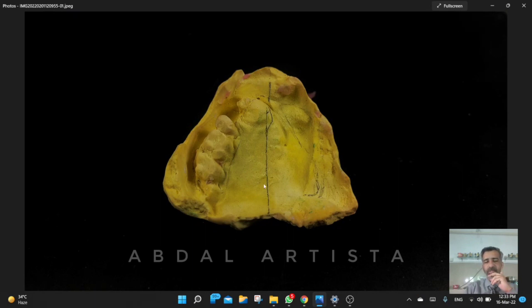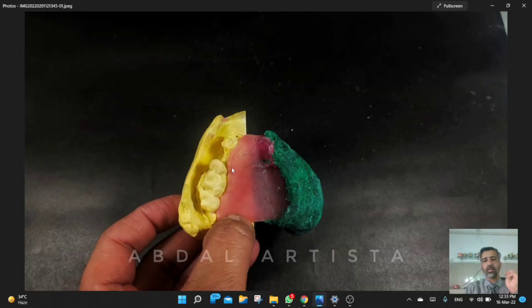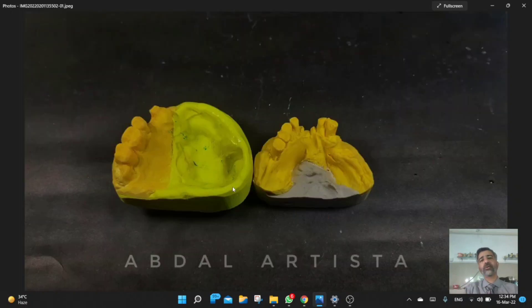We marked the area and cut the impression into two halves, then attached the custom impression tray to that part and sealed them together. After that we did the boxing of the impression. You can see the other view of that impression. We also created guiding locking holes and grooves so that both parts could be joined together properly, and here is the final model.